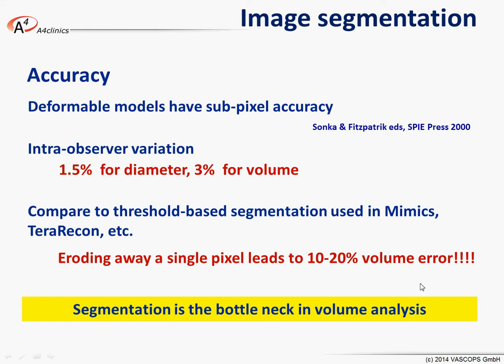So the conclusion here is that segmentation is really the bottleneck of a volume analysis, and you have to apply very accurate segmentation methods in order to end up with reliable volume measurements.